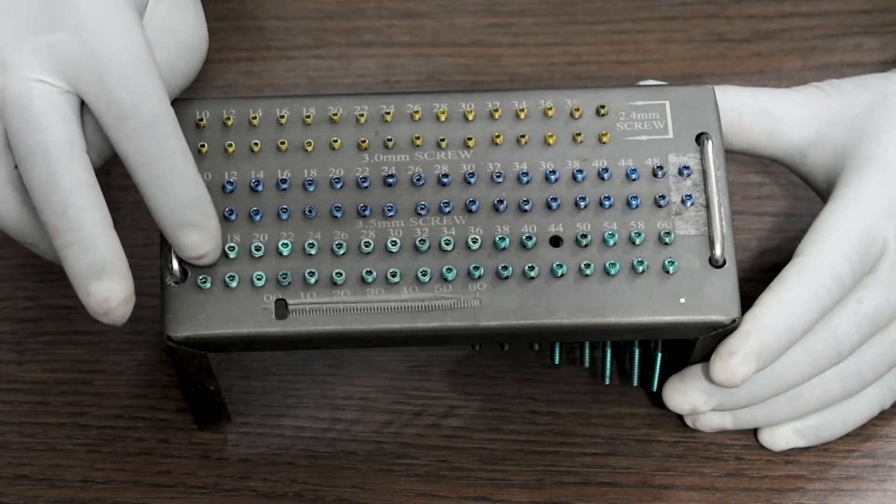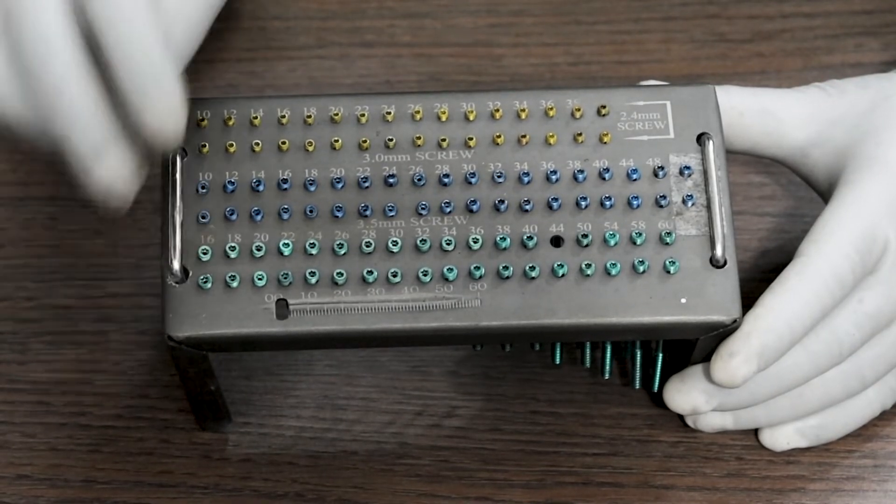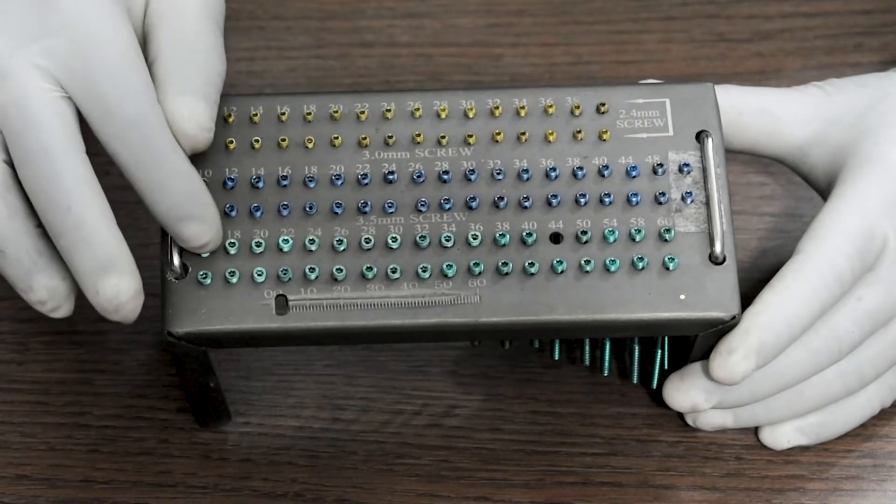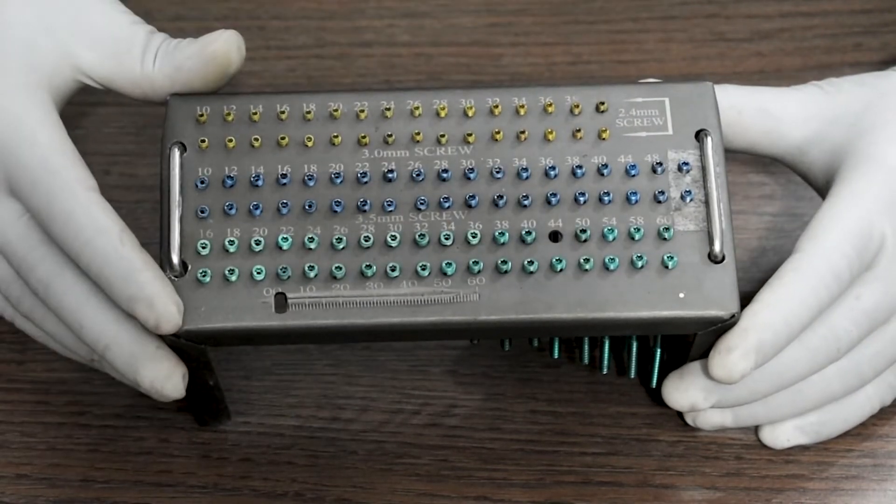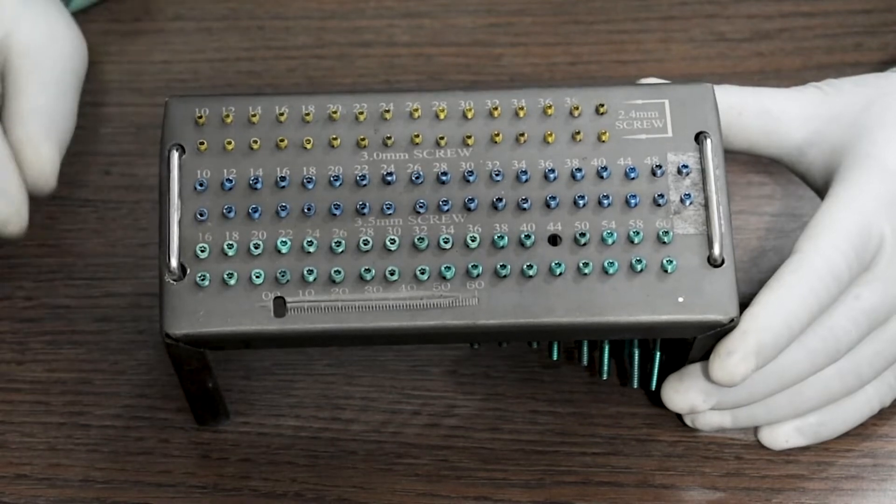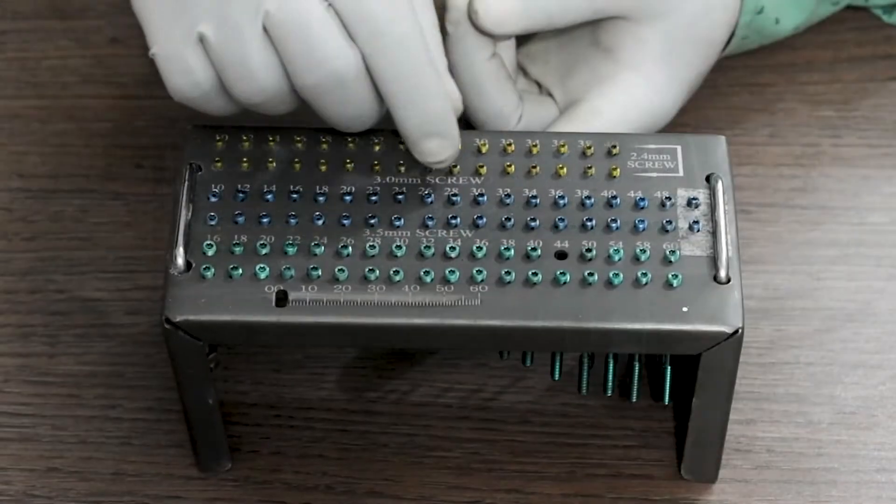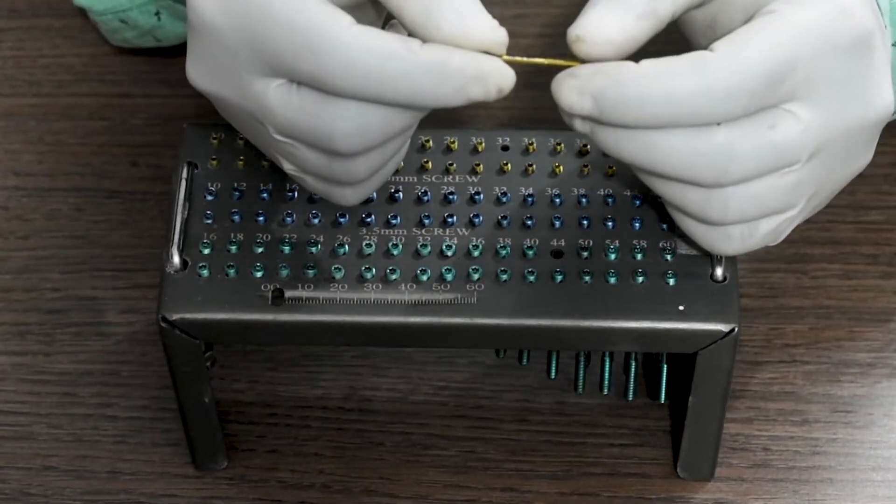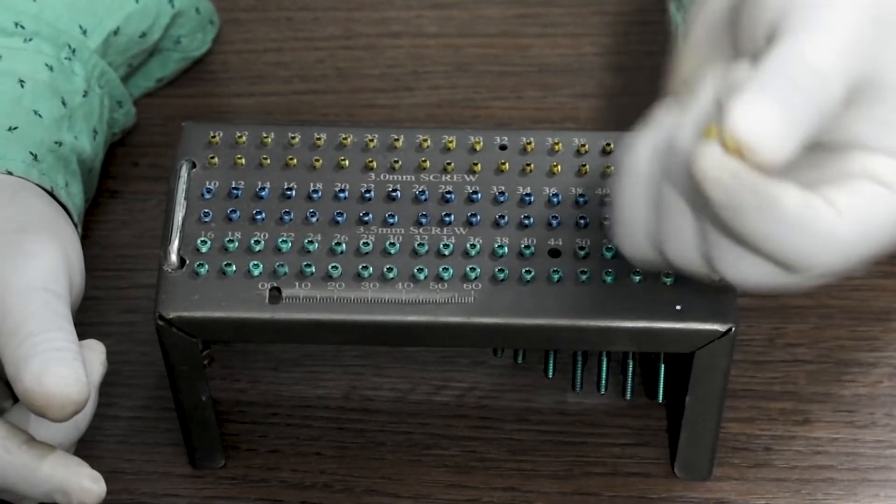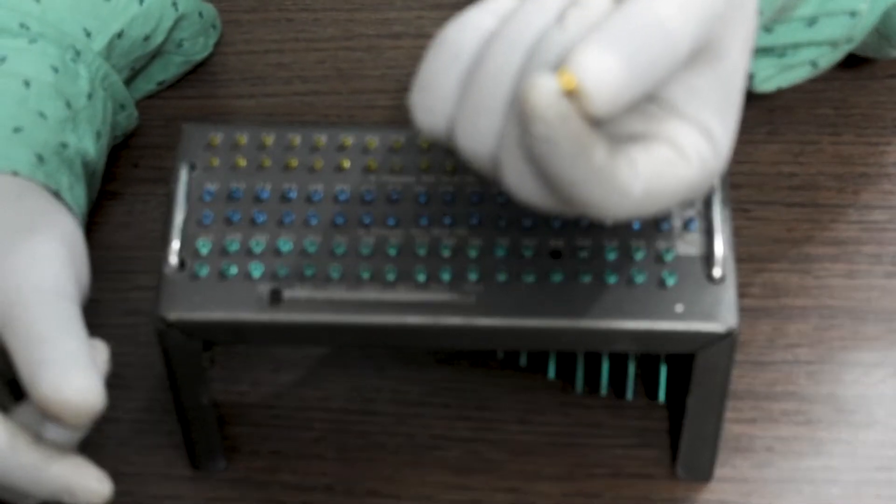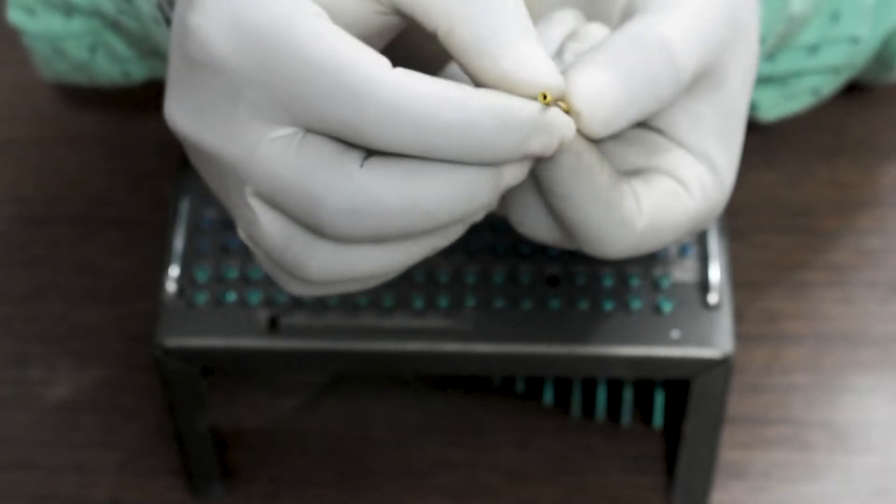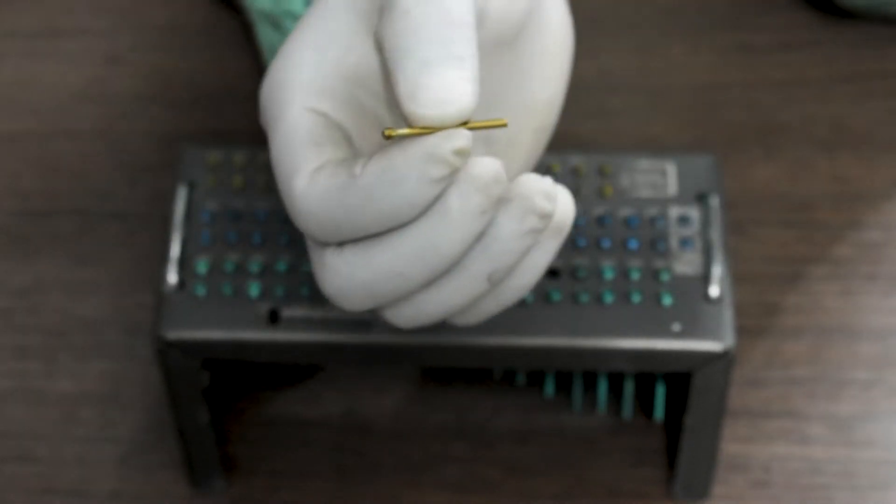And for 3.5mm, 16mm to 60mm, two pieces each. This is the 2.4mm Special Herbert Screw. It is cannulated, also called a headless screw.